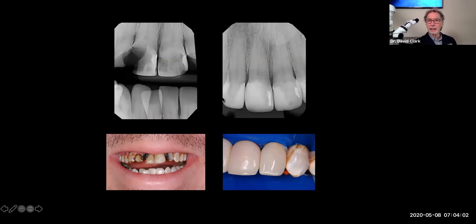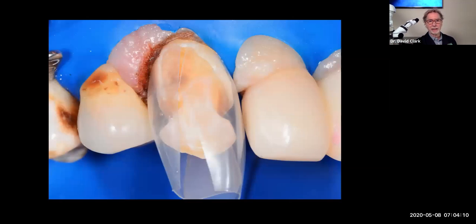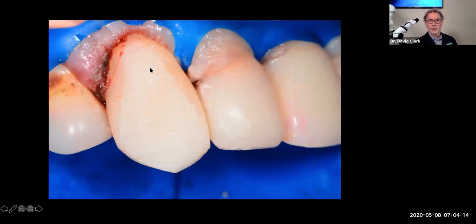Now, I did leave little bits of old composite that was well bonded. We did selective caries retention, which you really don't see on the x-ray. And he saved up his money. And here I'm going to go. I exfoliated some soft tissue. This rubber dam is not very good. His wife was a dental assistant, and he insisted that she assist. And her rubber dams were not very good. So I apologize for the rubber dam.